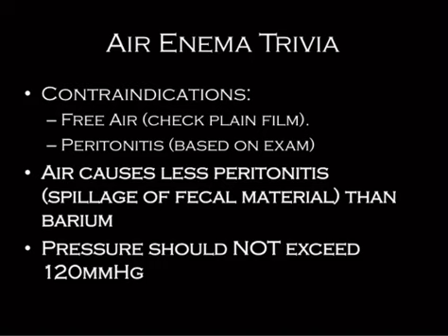The last thing to know is that there is a pressure limit. So if you've done one of these things before, when you're pumping the thing up, it sort of looks like the pumper on a blood pressure cuff, and it has a little gauge also. Probably different machines, but that's the one that I have used. You don't want to exceed 120. That's the typical limit. You may see slightly different numbers. 120 is the one that I would remember.